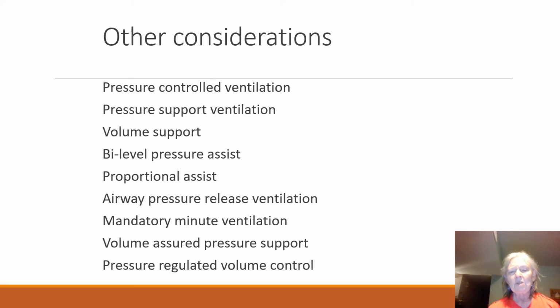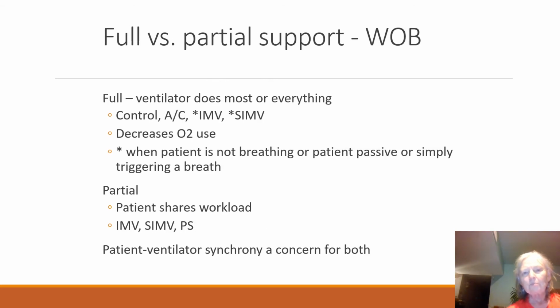We tried that at one time on an old Bear 1000 machine. Unfortunately, the machine and this did not work well. They're probably in the museum now. I have not seen any more in the hospitals, even as backup. Volume assured pressure support is another one, and then pressure regulated volume control is another one.